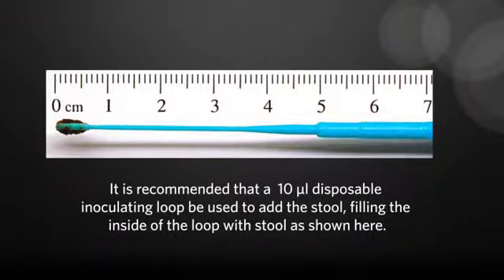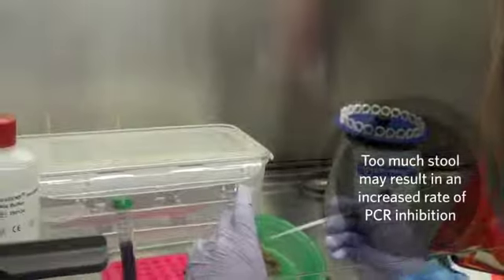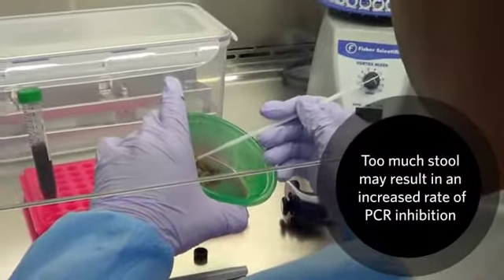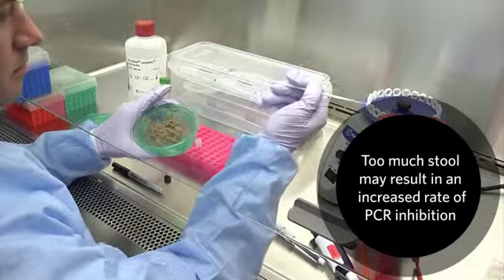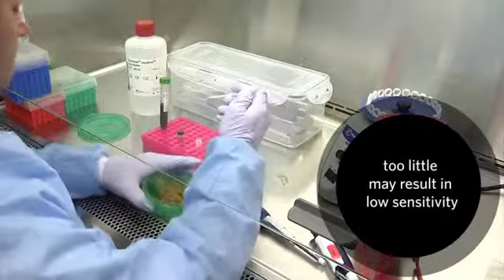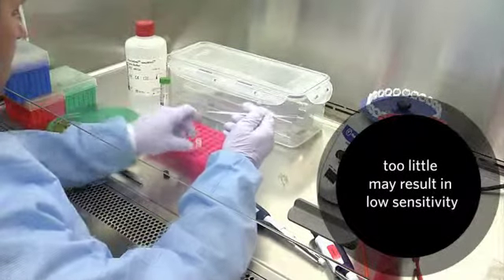It is recommended that a 10 microliter disposable inoculating loop be used to add the stool, filling the inside of the loop with the stool as shown here. Note, adding too much stool may result in an increased rate of PCR inhibition, while adding too little may result in low sensitivity.